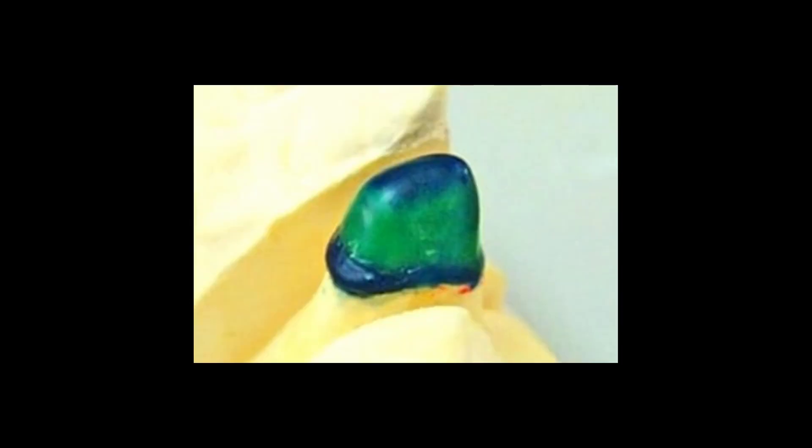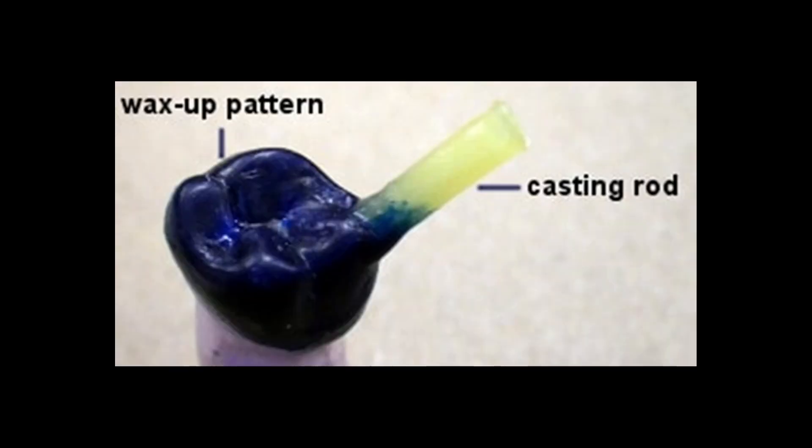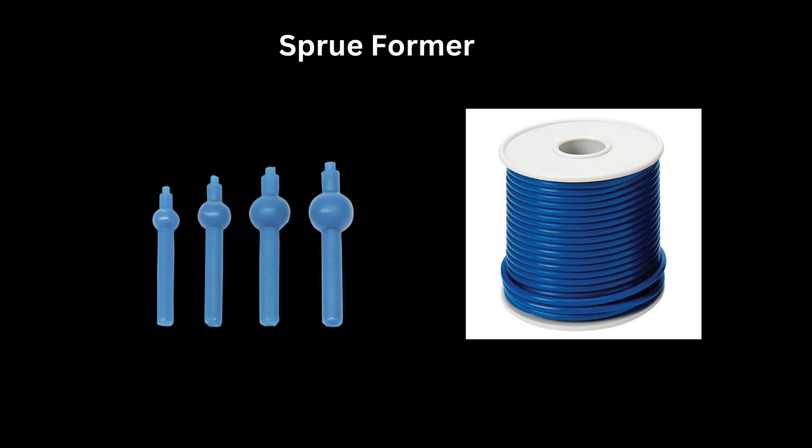Next, we melt inlay wax in small increments and build the pattern over this tooth. After this, we attach the sprue former. This is attached to the bulkiest portion of the wax pattern to avoid distortion of the wax pattern. You can also notice the reservoir here. This sprue provides a channel or tunnel through which the molten metal will enter the mold.